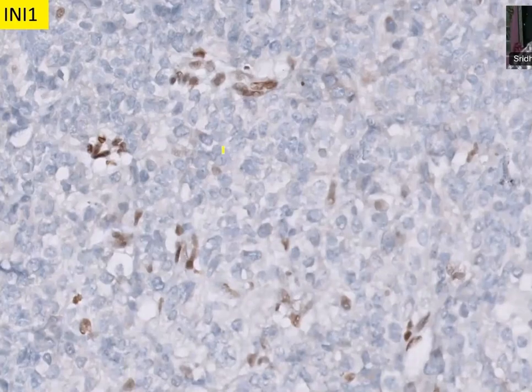What does it tell you? The loss of INI1 expression is seen, and it's an essential diagnostic criterion for ATRT. So in an infantile age group, loss of INI1 in embryonal morphology, when you have a divergent differentiation, SMA positive a bit and synaptophysin positive here, you should always think of ATRT, atypical teratoid rhabdoid tumor. Very good.